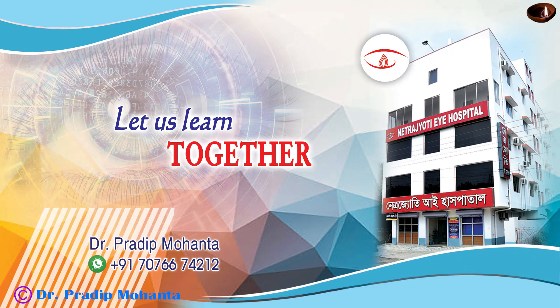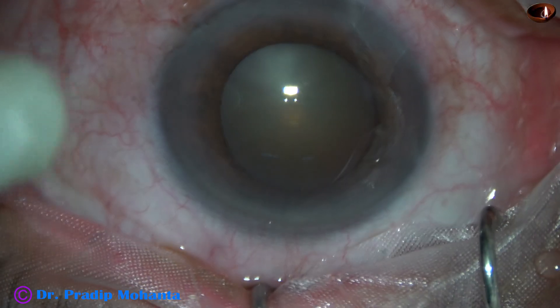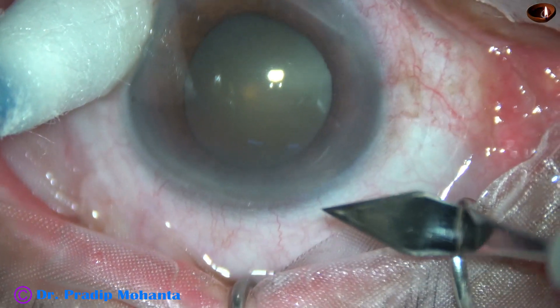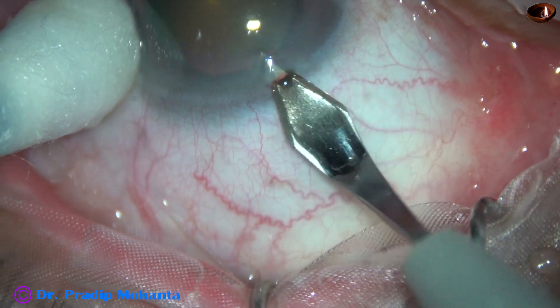Friends, welcome to my workplace at Ranaghat, West Bengal, India. This is a known case of IFIS — intraoperative floppy iris syndrome. The other eye had severe floppiness of the iris during surgery, so I have planned this surgery in a slightly different way. Let us observe this.